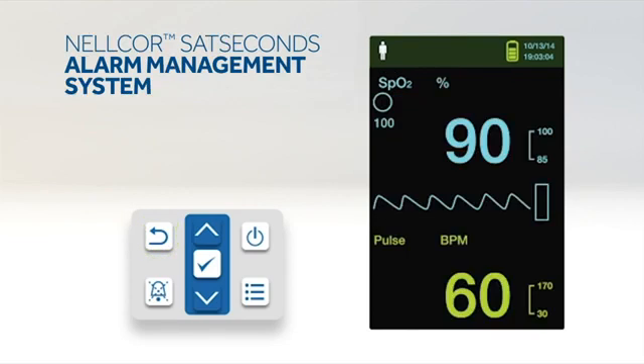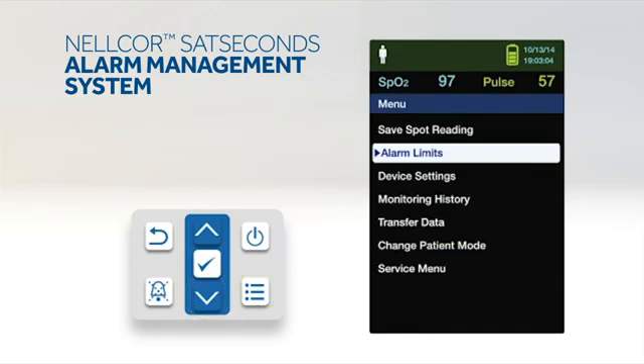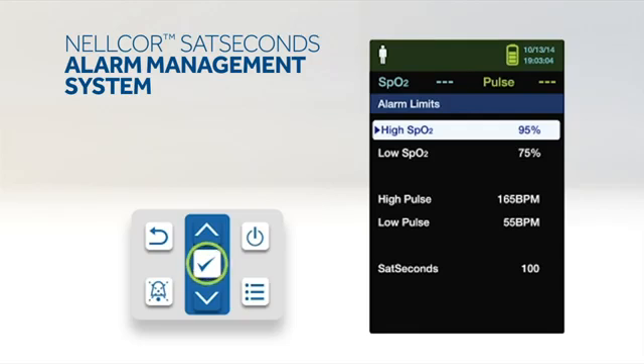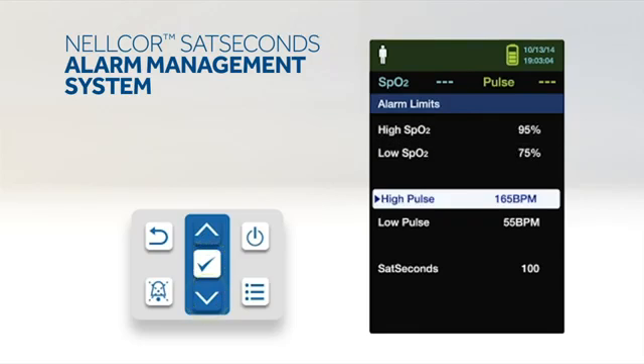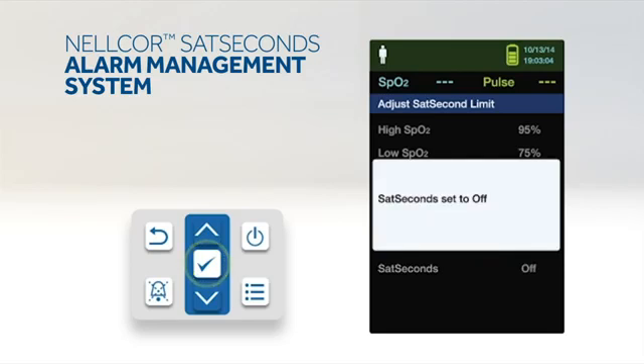To set Nellcor SatSeconds, press the menu button, press the down button to highlight the alarm limits menu item, and press OK. On the alarm limits menu, press the down button to highlight SatSeconds. Press the down arrow to change Nellcor SatSeconds to 50, 25, 10, or off. Note that the default value is 100. Finally, press OK to select the value.